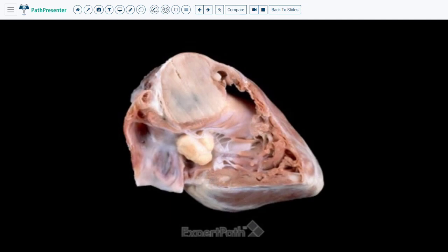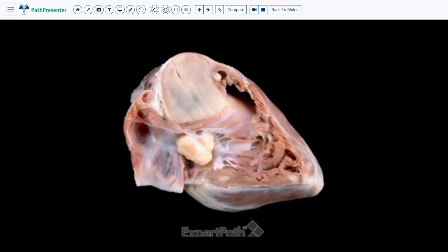Case two is rhabdomyoma. This is a gross picture of a heart with numerous rhabdomyomas. You can see a large one right here which has been cut. There is another one right here, there is a small one right here, and then there is another one right here. Orientation of this heart is a bit difficult because of the way it was cut. Let's go on to the histologic section.